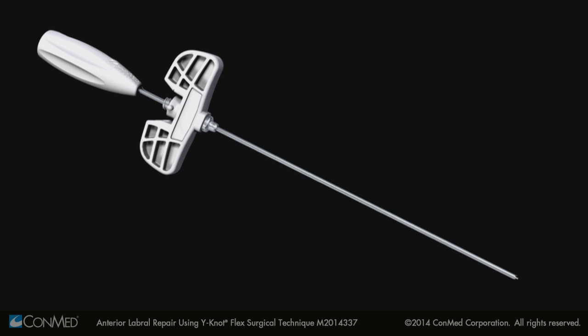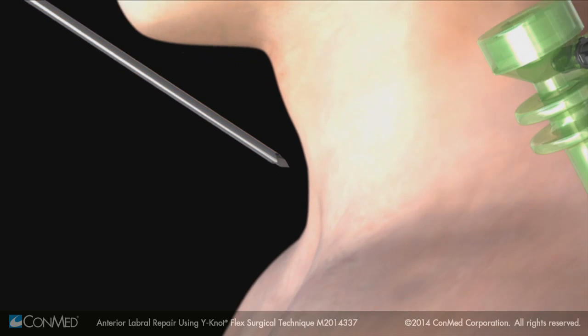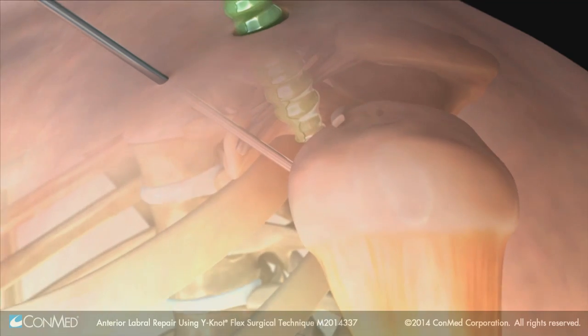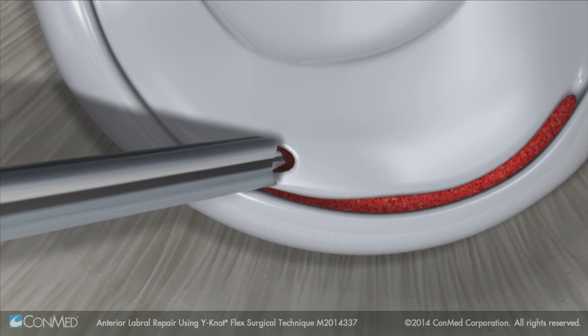The Y-Knot Percutaneous Kit offers a simpler and more minimally invasive approach. After finding the proper trajectory with a distension needle, recreate it with the sharp Trocar T-Guide. Then use the flexible drill guide to create the hole.